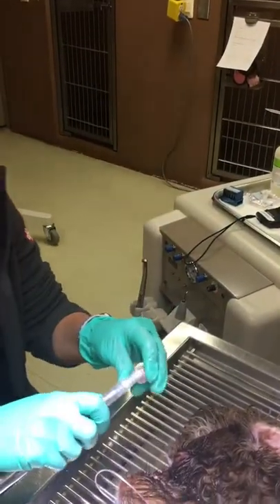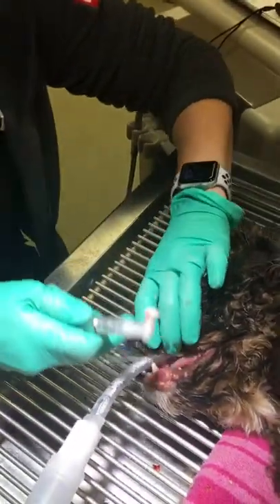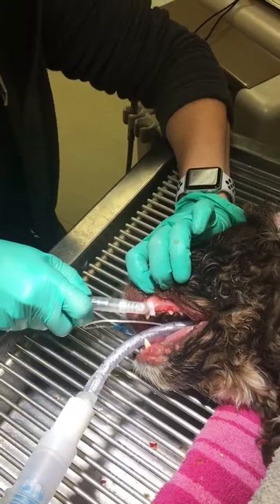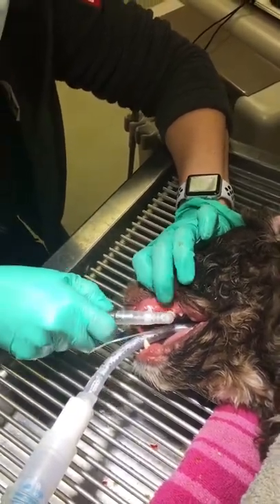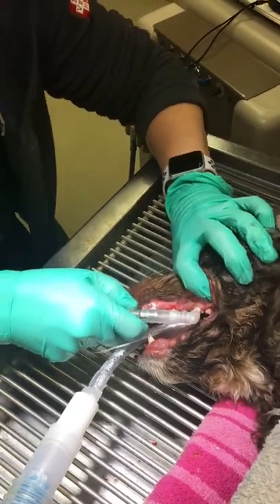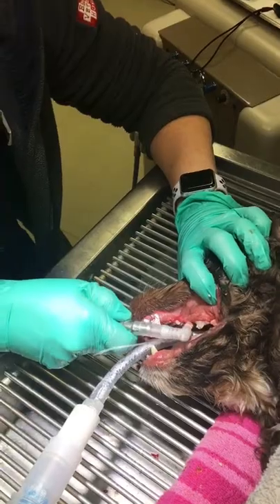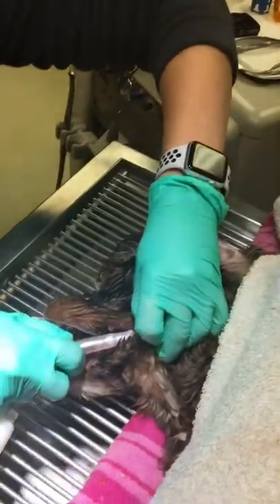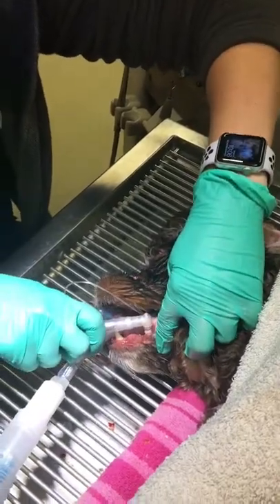Polishing is necessary to smooth the surfaces that have been microscopically scratched during the scaling procedure and to remove any existing stains that were not removed by the scaler. Make sure to use care while polishing to not damage the tooth. This means using adequate prophy paste and a low RPM. Only polish for 1 to 3 seconds on each tooth surface, then rinse the prophy polish away.